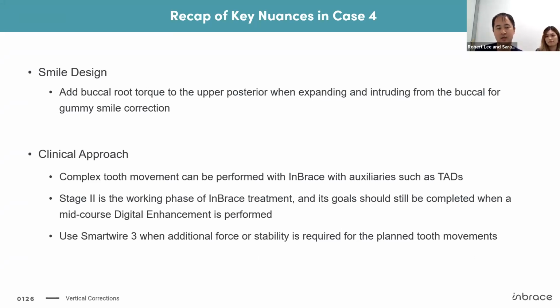And then keep in mind that stage 2 is that working phase of InBrace treatment. So even if you did, say, a mid-course digital enhancement, that doesn't mean you've completed all your goals of stage 2. You should still always complete every goal between stage 1 and stage 2 as you're going through the standard treatment sequence, and use SmartWire 3 when additional force or stability is required for the planned tooth movements.